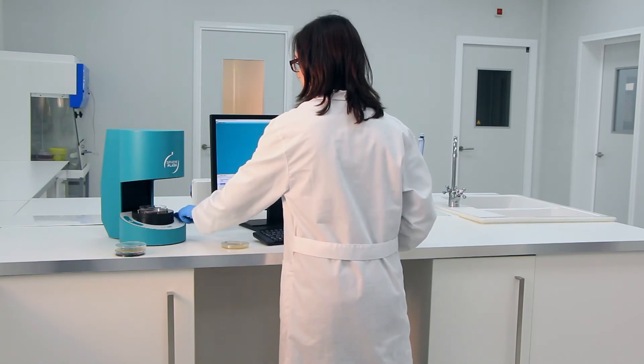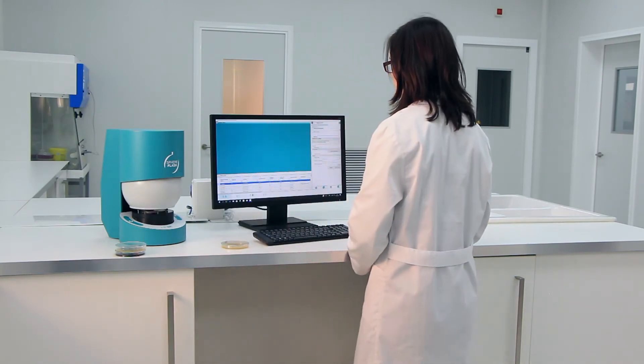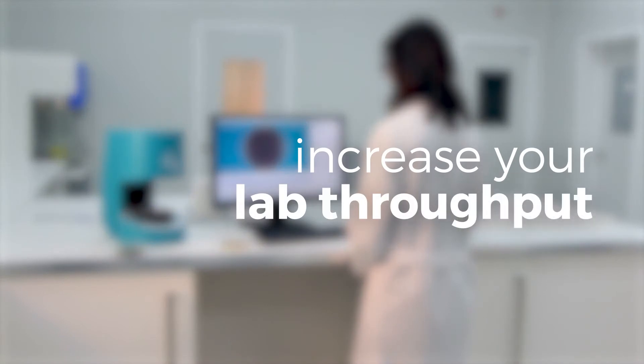Image capture and data delivery happens in the blink of an eye, eliminating an important bottleneck to increase your lab throughput.